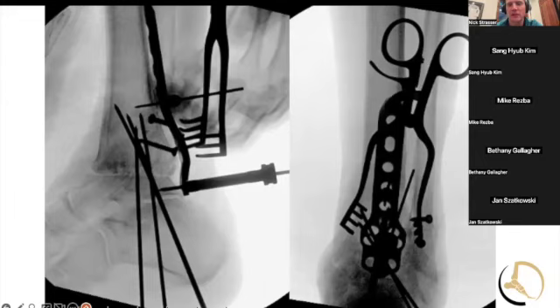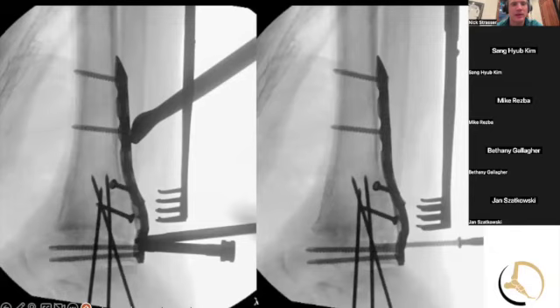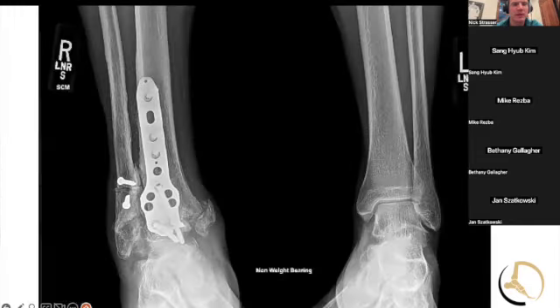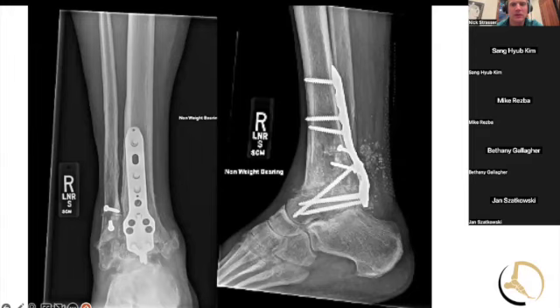to fix it. I closed down her lateral side, and nothing too fancy, screws going in across that area. I didn't use any percutaneous screws. I felt like I got good purchase and compression. I used, I think, some proximal tibial autograft into that area, and these are my immediate post-ops. You can see where I cut the medial mal in an effort to get that translated posteriorly.